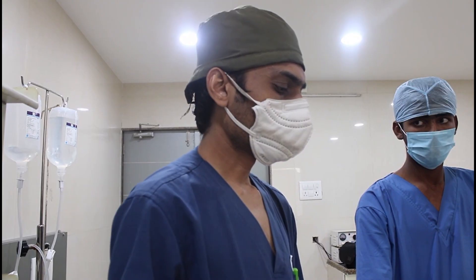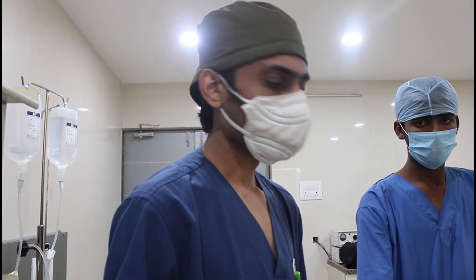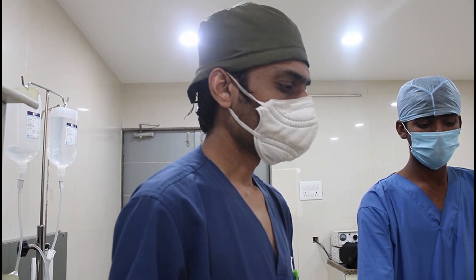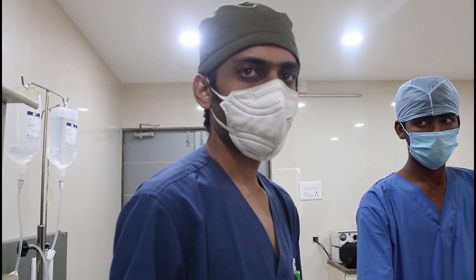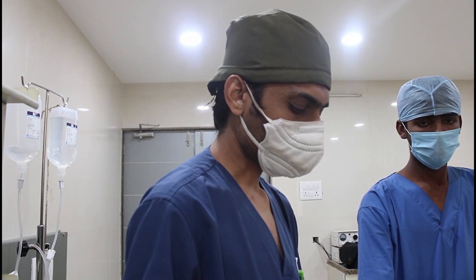Good evening friends. Today we are planning to give a supraclavicular brachial plexus block for a radius-ulna nailing surgery. This is a 9-year-old boy. We are planning to do radius-ulna nailing and for that I am giving a PNS-guided supraclavicular brachial plexus block.